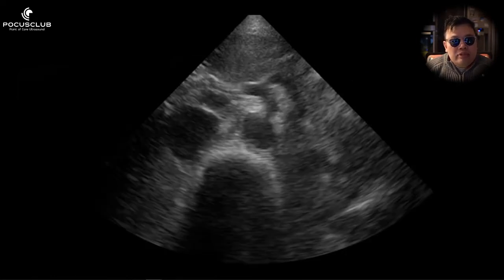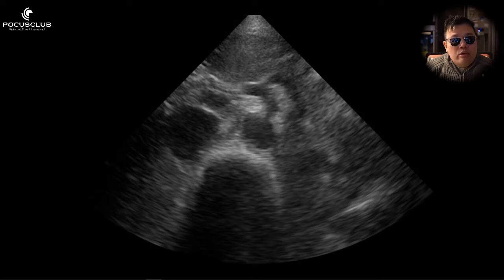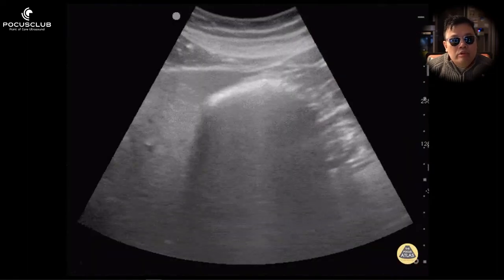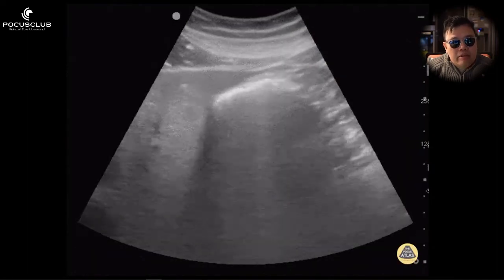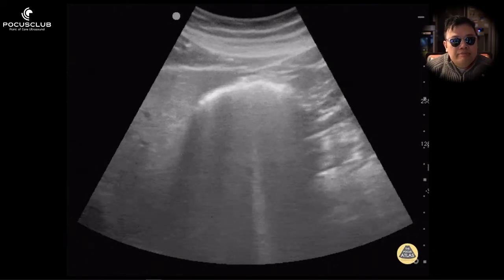The reality of the situation is that you are taught to scan the aorta wrong. You are taught to start from the epigastrium. When you invariably scan, you get this perfect view where you can even see the celiac plexus. When you go to scan a real-life patient, this is oftentimes what you see.